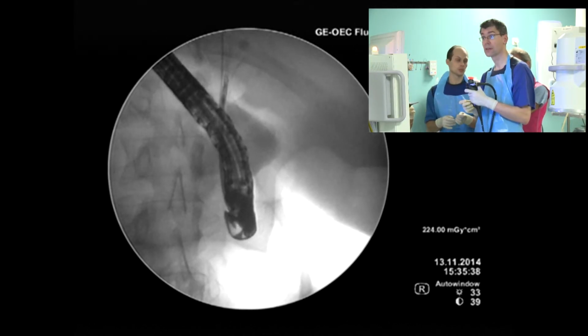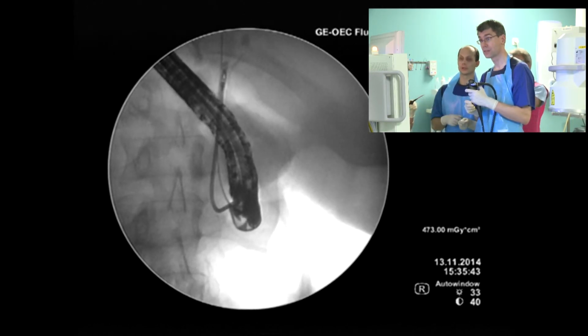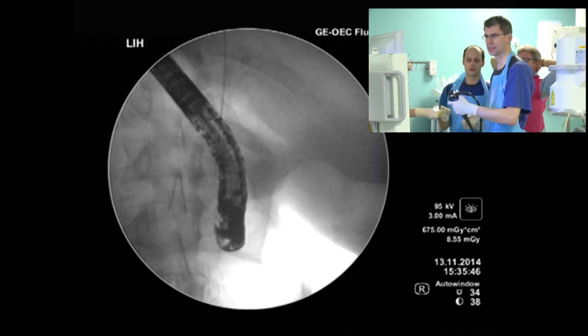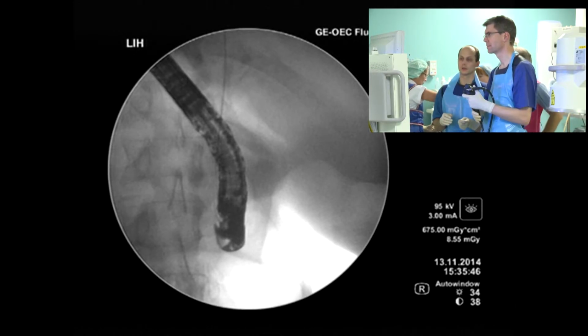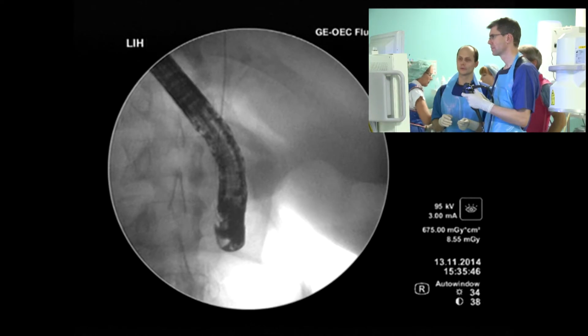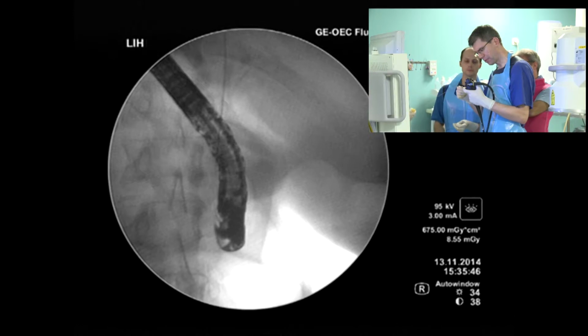The pictures we will have will be different. Yes, we work the same way. The material is placed in different tubes, and of course, it will all be marked. And another question. Do you place the biopsies into formalin or a transportation medium? We use formalin. It's formalin.